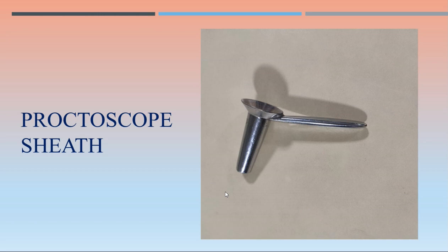The next one is the proctoscope sheath. The proctoscope sheath looks like this — this part goes inside the anal canal after placing the patient in a suitable position. Just try to identify: this is the proctoscope sheath, used in per-rectal examination and proctoscopy examination.